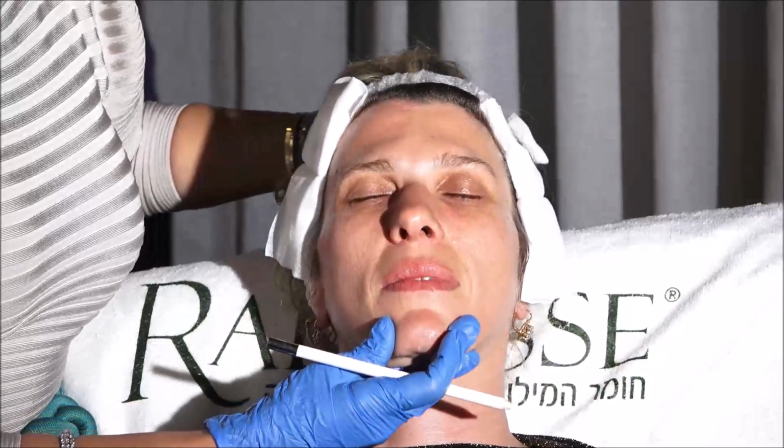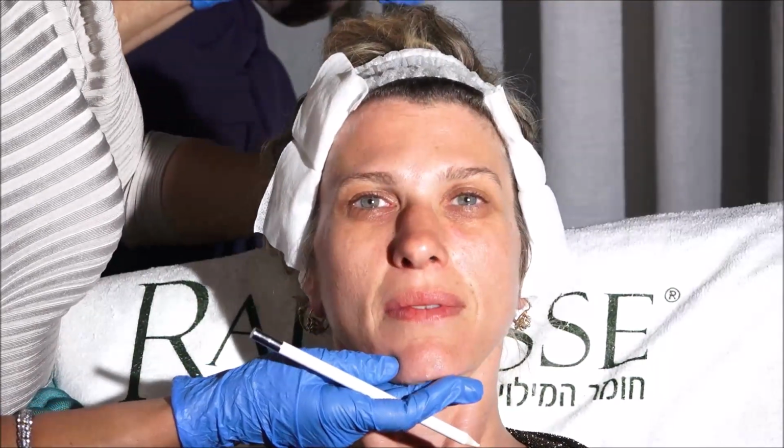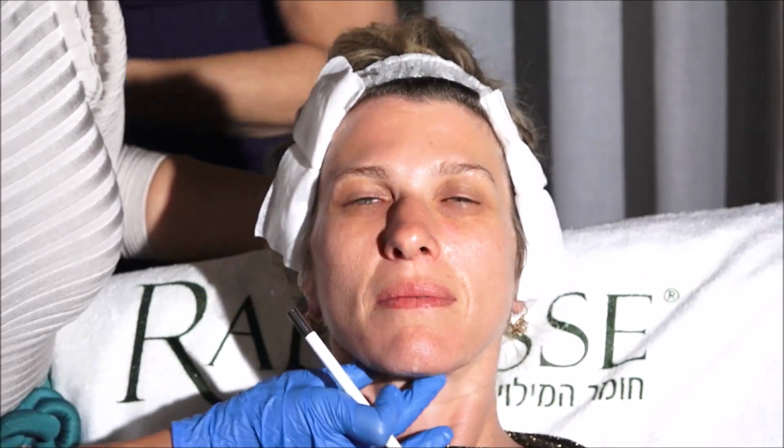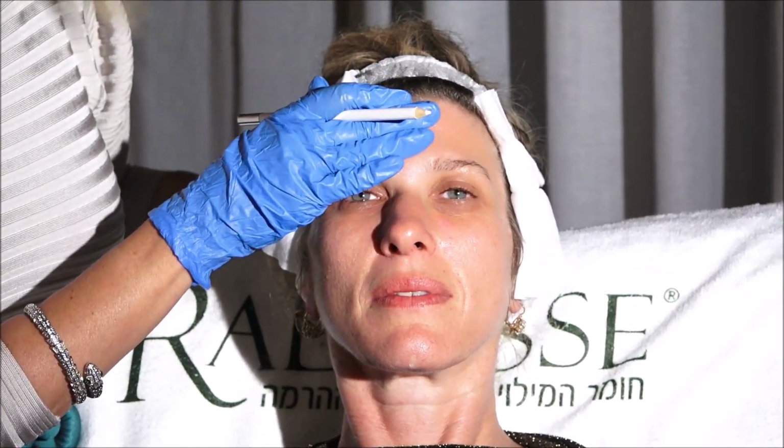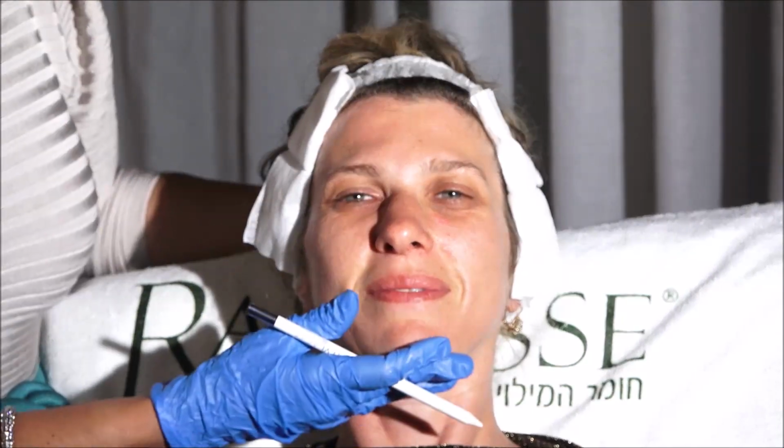So this beautiful patient, EL, I asked her, what bothers you? So she said, nasolabial fold and this. So I'm going to do the injection of the toxin just for teaching purposes and for her to be more beautiful, but the focus is on this.